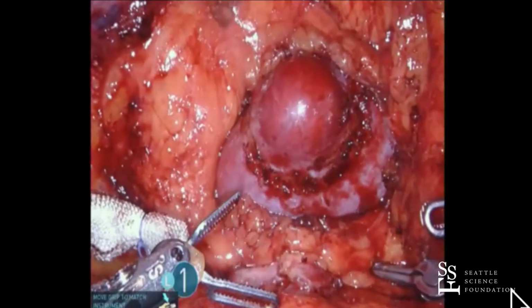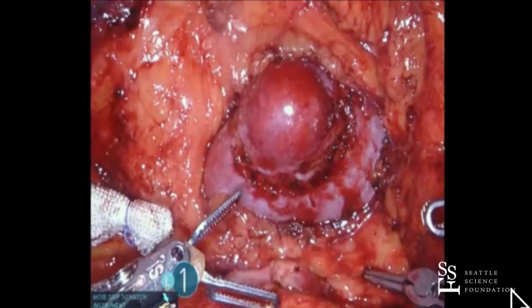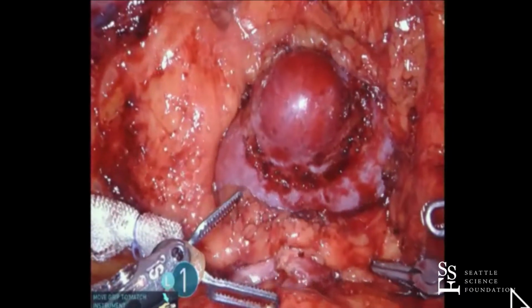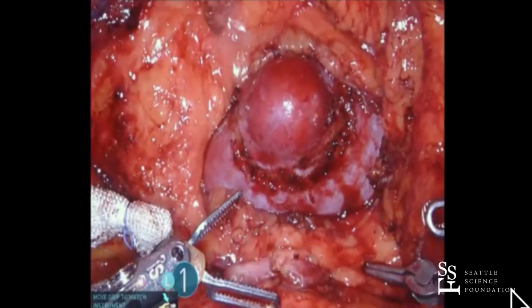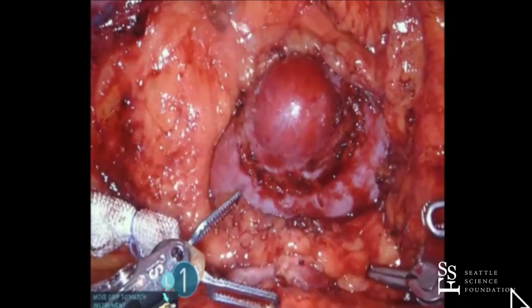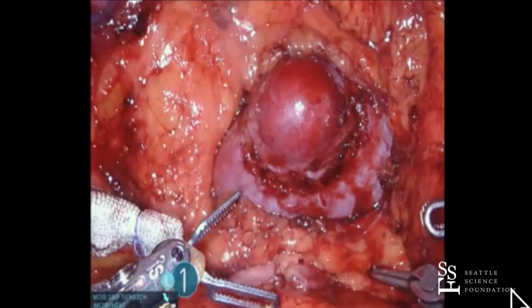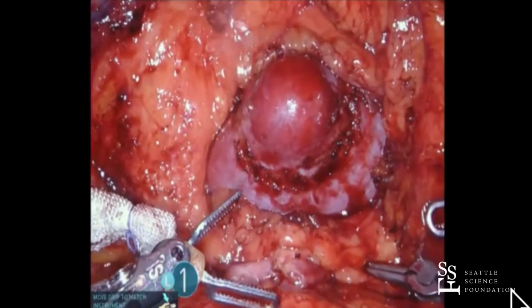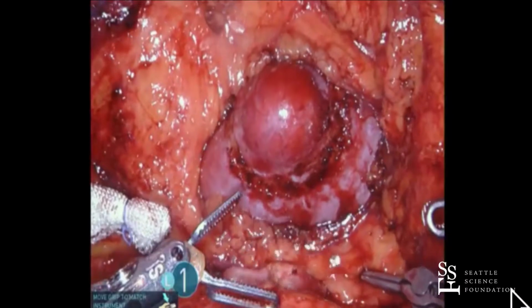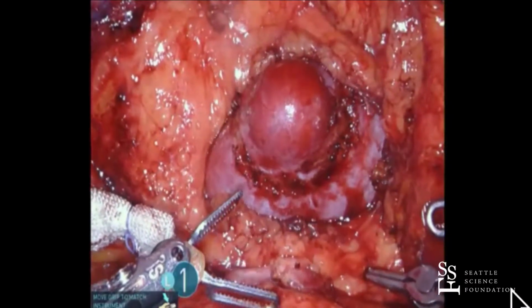Yes. And then we throw the bag in the low retroperitoneum, and then I go to needle drivers, and then I do my suturing. So my renorrhaphy is different than Ronnie's, which is different than Caton's, which is different than everybody's. Everybody's got their own renorrhaphy, it seems like. Everybody cuts tumors out pretty much the same, although you could argue enucleation, but I think renorrhaphy is kind of dealer's choice, and what I do is usually this kind of three-layer repair.